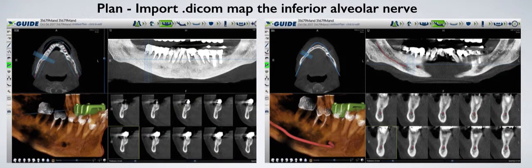These are the planning screens. You can see the CBCT has been taken with the X-Clip on the left screen, and the arch is being mapped. On the right screen, you can see the mandible, or inferior alveolar nerve, is being mapped.